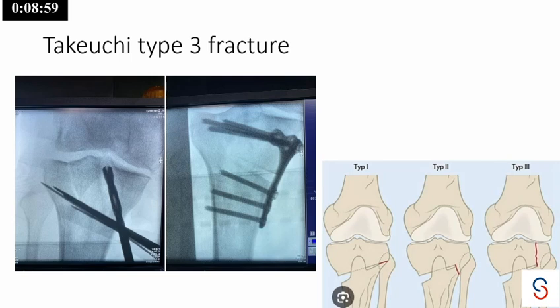Chirag, what's your opinion on the off-the-shelf products which harden after you inject them? So gel kind of materials. For this? Yeah. No. Definitely not. I mean, it's like putting a glue, you are telling. Yeah, so something like bio-inductive putty or something. Could be, but I have no experience with that. I mean, anybody can share that. You're free to. So that's what we have.